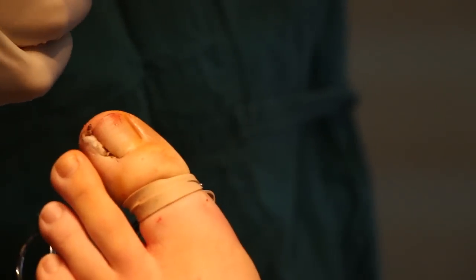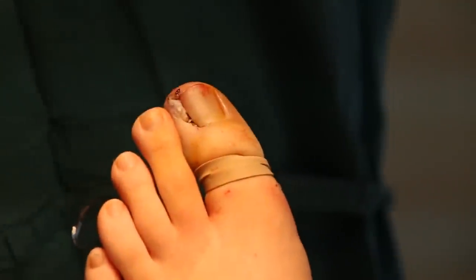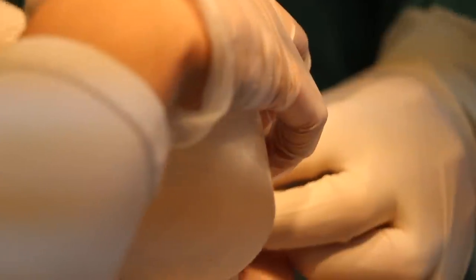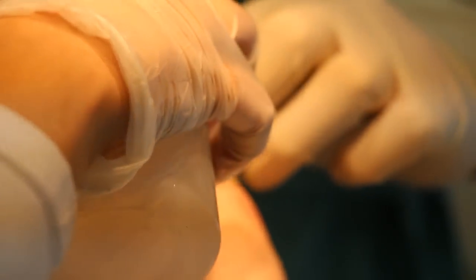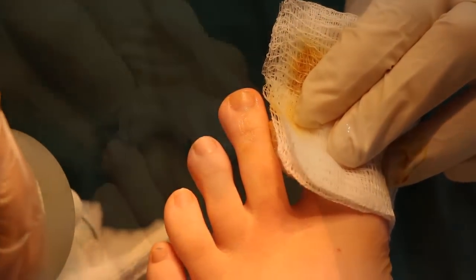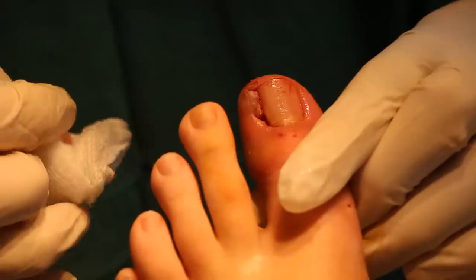Now I'm going to rinse off the excess phenol and neutralize what's left so it'll stop working. A little bit more. I'll release the elastic band with a little betadine — iodine on your toe. We're going to clean up the foot with a little peroxide. And you can see the ingrown nail is gone. It's going to be a nice looking nail — just a little bit narrower than before. We're going to put a little ointment on the toe, and that's it.